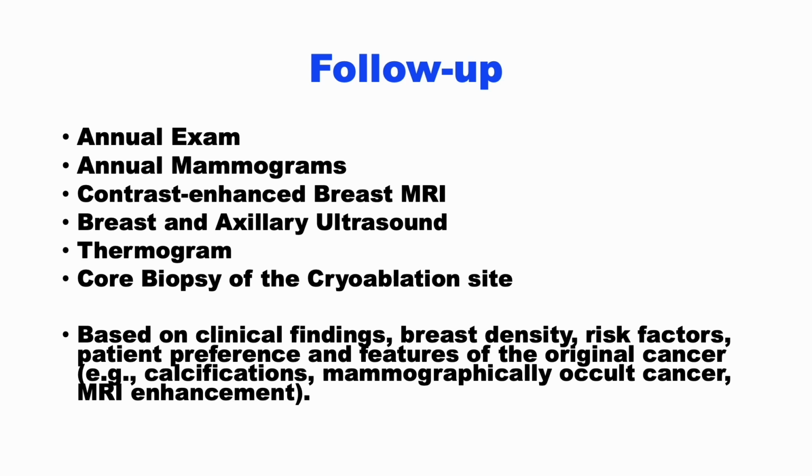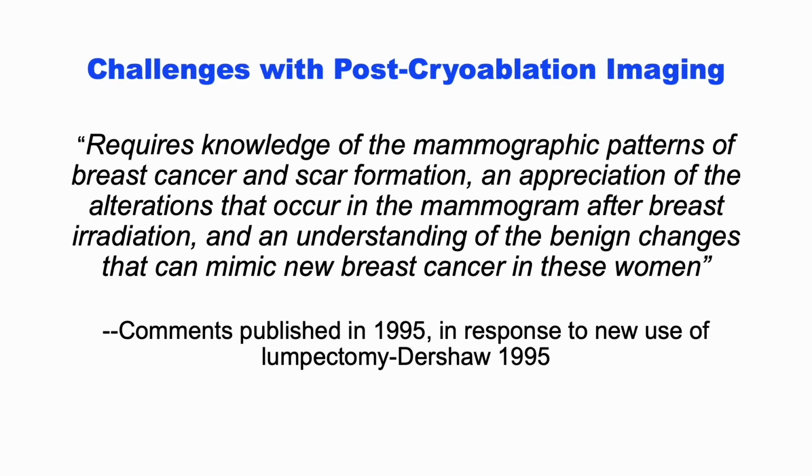Nonetheless, tissue changes within the zone of inflammation, combined with the usual difficulties of detecting microscopic disease, frequently justify routine image-guided biopsy to exclude recurrent or residual disease.